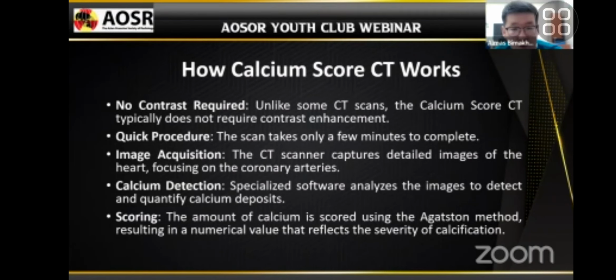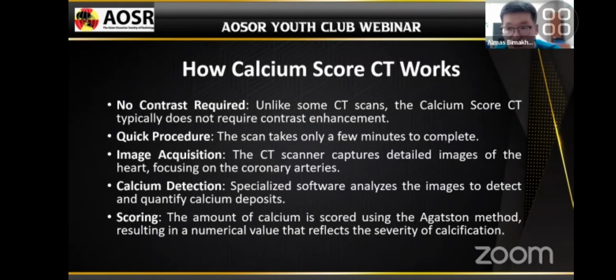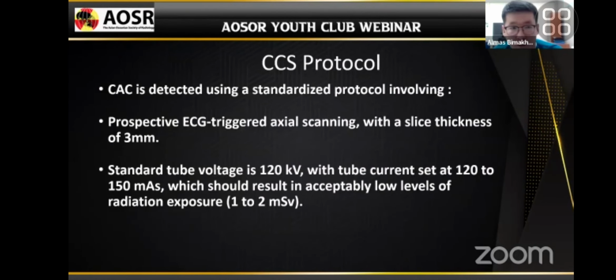A specialized software analyzes the image to detect and quantify calcium deposits. The amount of calcium is scored using the Agatston method, resulting in a numerical value that reflects the severity of calcification.